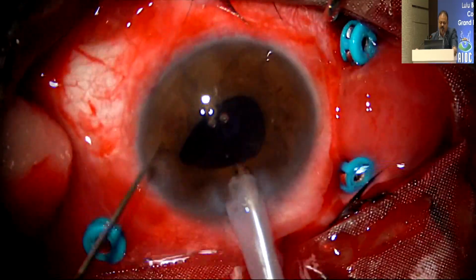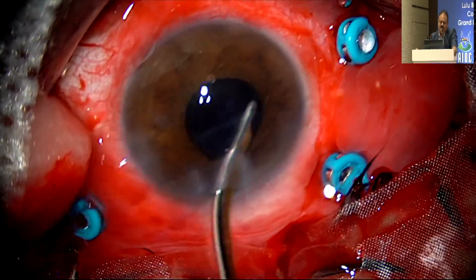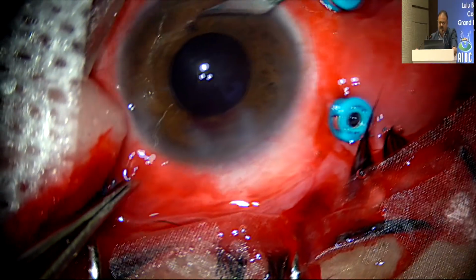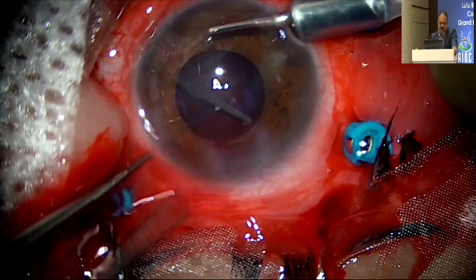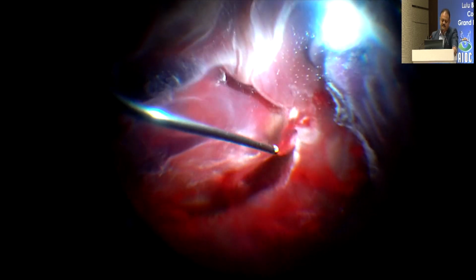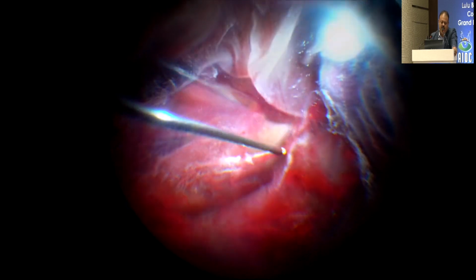After removing the lens, we put an AC maintainer. Now we can see a little bit of retina, not the retina, I would say the detached retina with a choroidal rupture and suprachoroidal hemorrhage. The vitreous hemorrhage was also very difficult to remove. So with a lot of patience, we gradually removed the hemorrhage because we had to get the posterior hyaloid face, remove it before we inject PFCL.